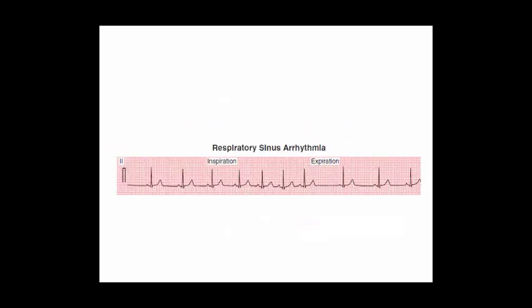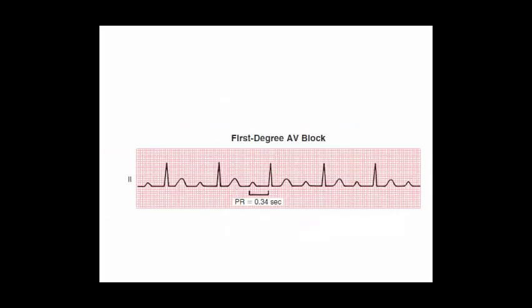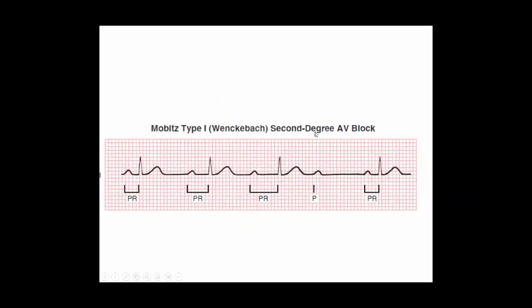Very rapidly, to end our discussion, we will cover very fast the heart block. The heart block, with ECG, I have a P wave causing the QRS complex. The relation between the P and the QRS complex is the PR interval. And if this PR interval exceeds 5 small squares or 1 big square, this is called prolonged PR interval, and this defines the first degree heart block. If some P waves are not conducted and cause a QRS complex, we are in the second degree heart block.